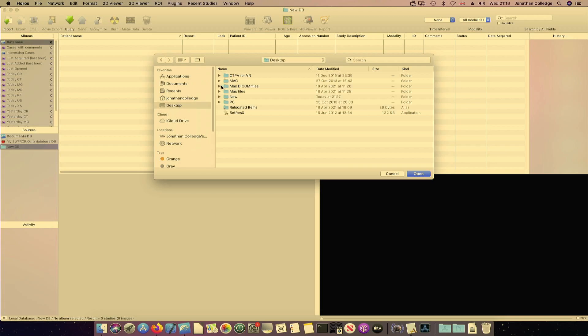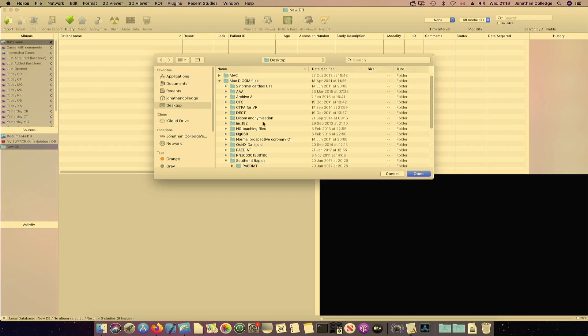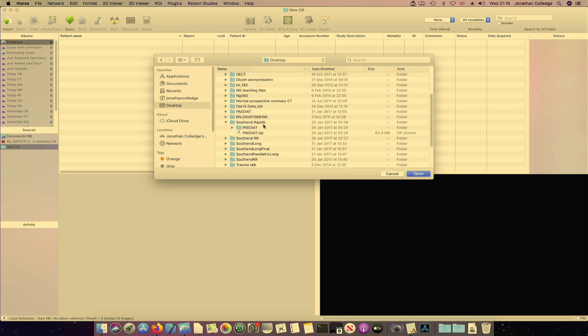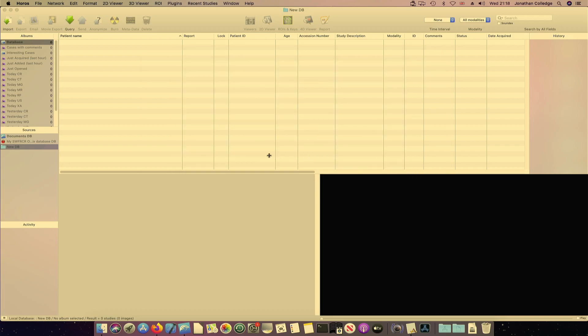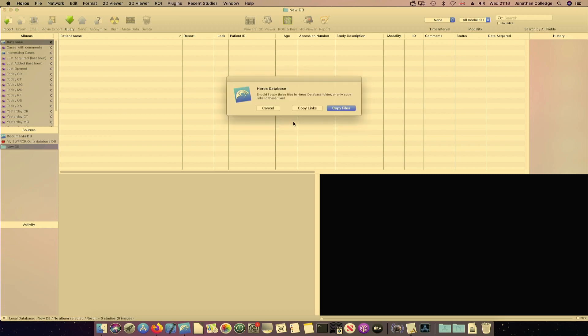So Desktop, Mac DICOM files. Let's go for something that I know will open quickly. So Southend Rapid Reporting. I'll just click No there. And this is the important bit. I'm copying links to the database. I'm not copying the files. Copying the files will duplicate the files and you will run out of disk space very rapidly. So let's copy links.